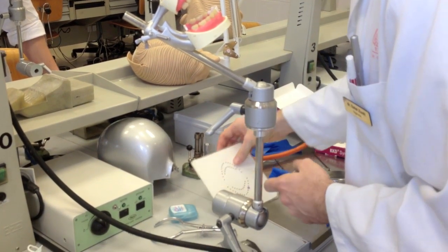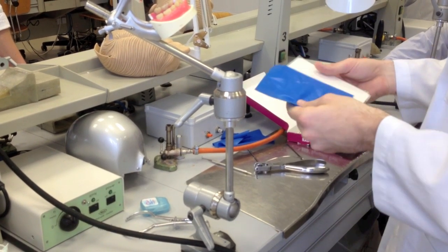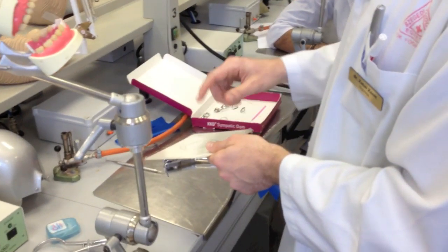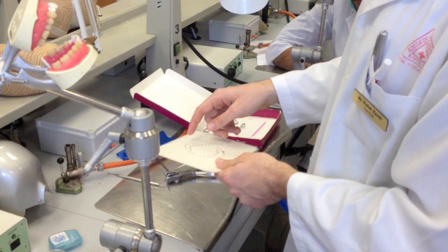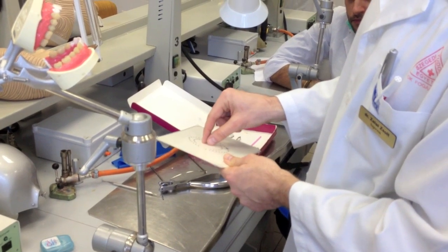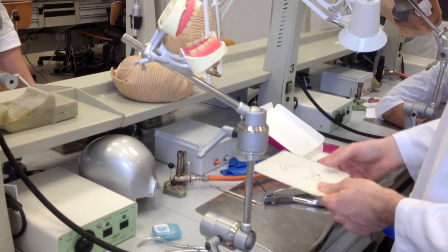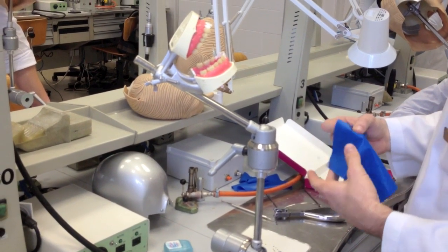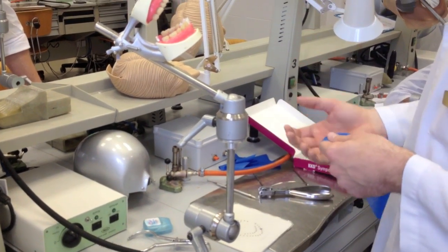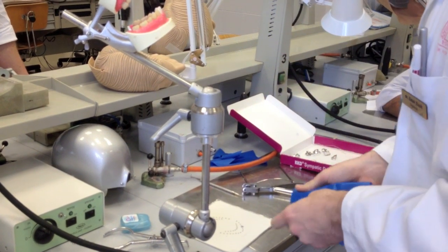First of all, how to decide where to make the holes. We have this template — we have maxillary and mandibular arch, they are a bit different. We have adult and child, but I do not recommend trying to place rubber dam for children. Try to use materials which are not that sensitive for moisture, and that you can work much faster — for example, glass ionomer — then you don't have to use rubber dam.